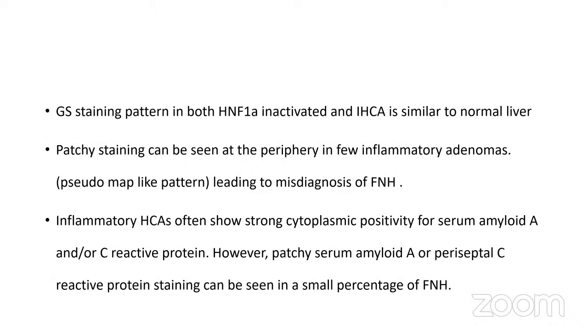The glutamine synthetase staining pattern in adenomas is similar to normal liver, and inflammatory adenomas can have patchy staining, and I'll show you an example in the next slide. This can be misdiagnosed as a map-like pattern, especially on needle core biopsies. Inflammatory adenomas also have strong cytoplasmic positivity for serum amyloid A and/or C-reactive protein. However, patchy serum amyloid A or C-reactive protein can also be seen in a small percentage of FNH.